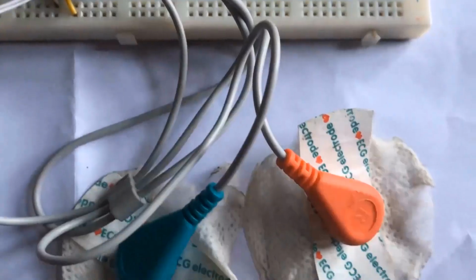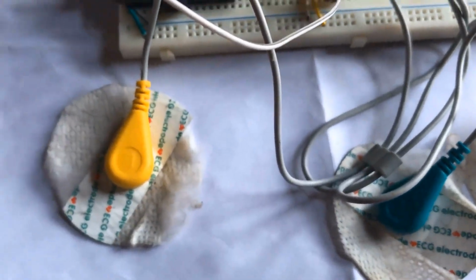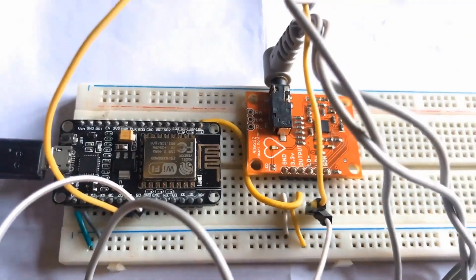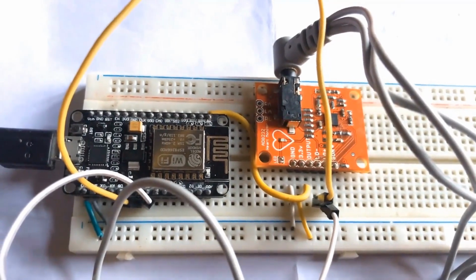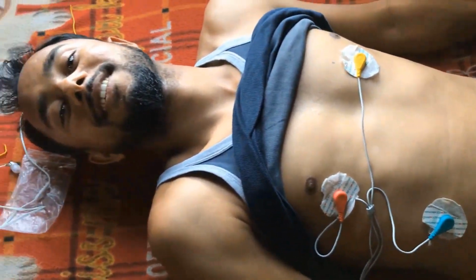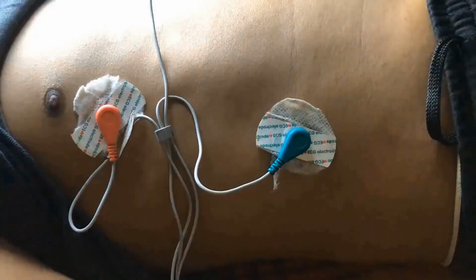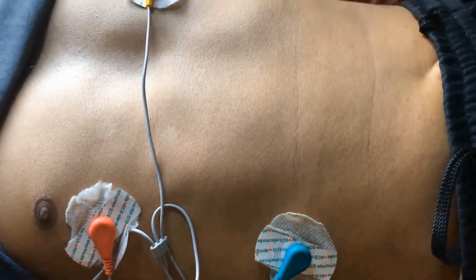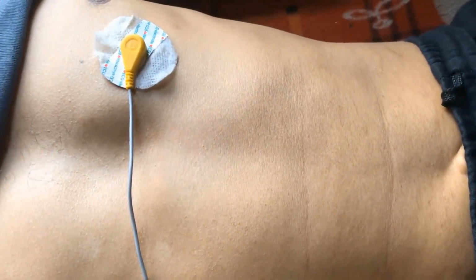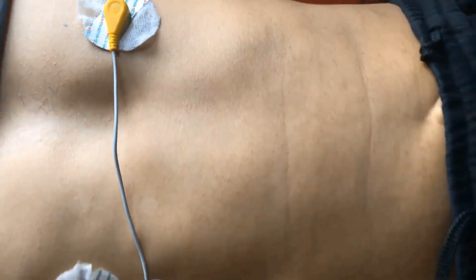We have 3 electrodes, that is ECG leads. All these ECG leads need to be placed in a triangular shape, either on the chest or on the arm or on the leg. So here is one of my friends where I'm just demonstrating how we can put the ECG electrodes. So the red one is on the left chest, yellow on the right, and the green at the bottom near the kidney section. So it's a complete triangular shape.